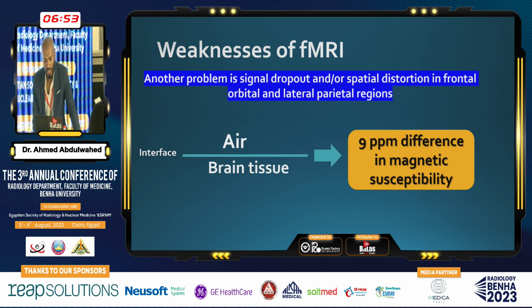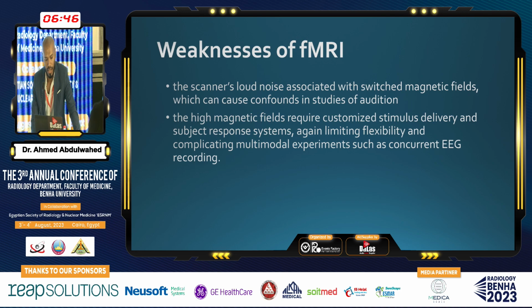This is because the interface between the air and the brain tissue will result in a 9 parts per million difference in the magnetic susceptibility. Another weakness is the scanner's loud noise associated with switched magnetic fields, which can cause confounds in the studies of audition.